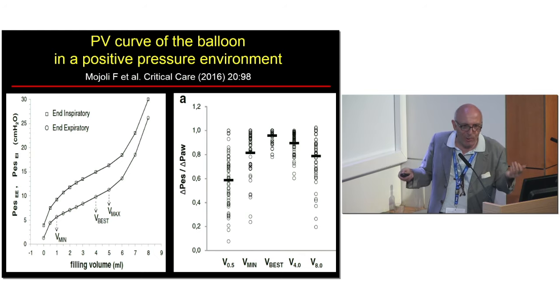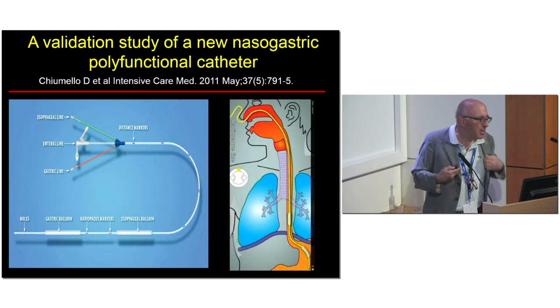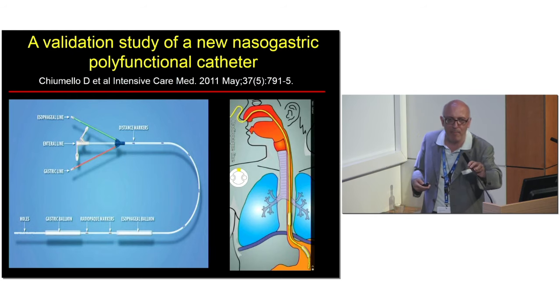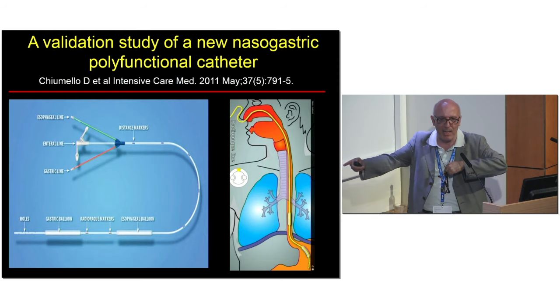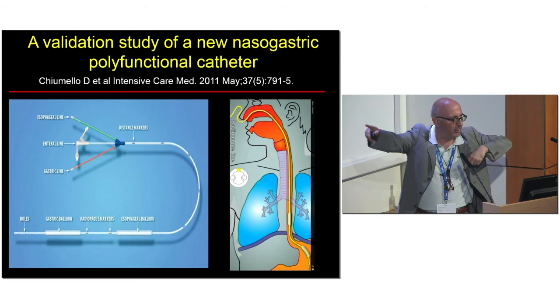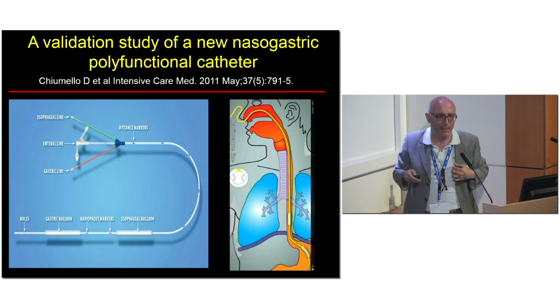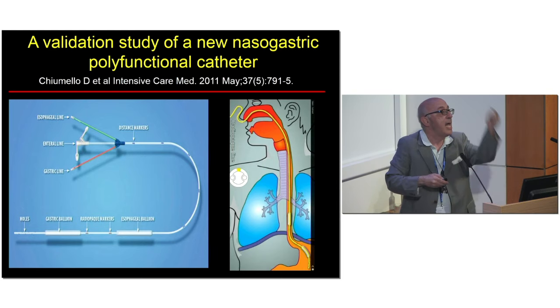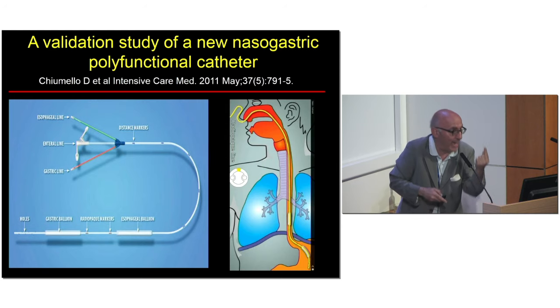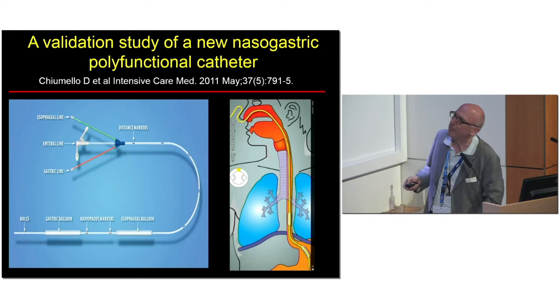Can you imagine a large randomized trial with that? Or at night, in my busy ICU with 35 beds, with trauma coming, cardiac arrest, intra-abdominal pressure, consultants, and then we measure the calibration of the esophageal balloon one time, because we don't know what happens after 1 hour.